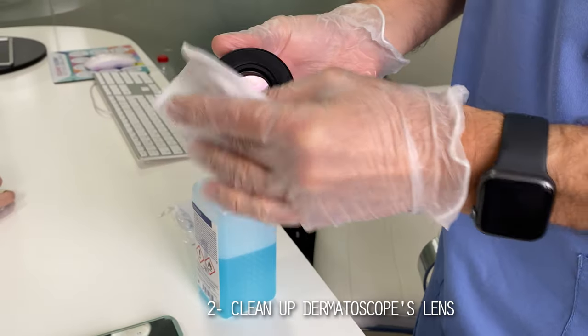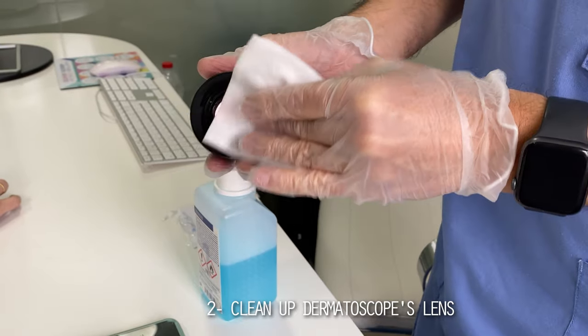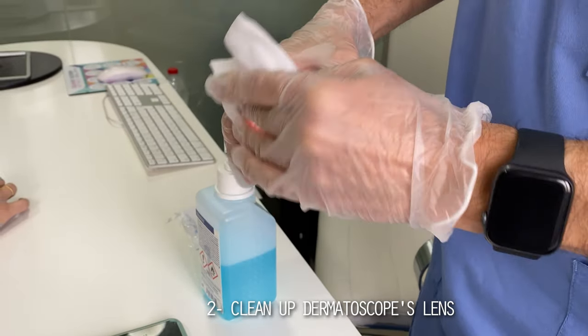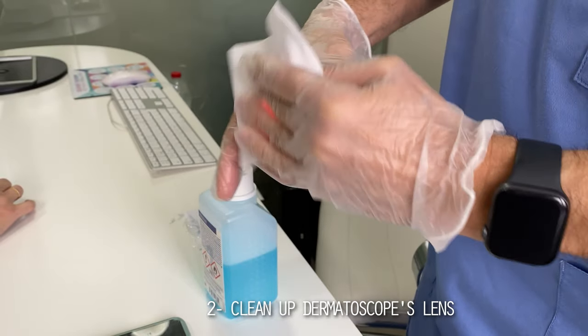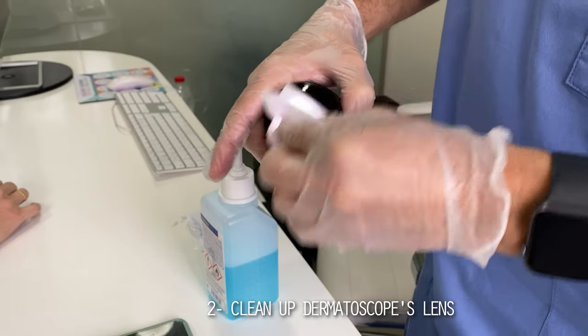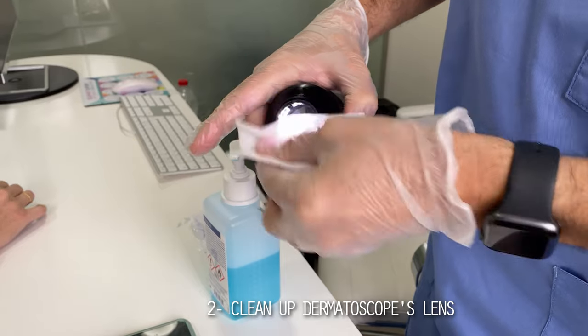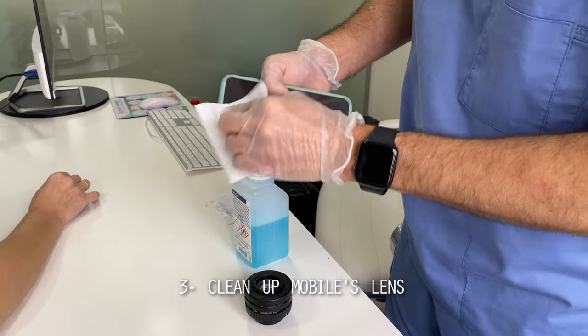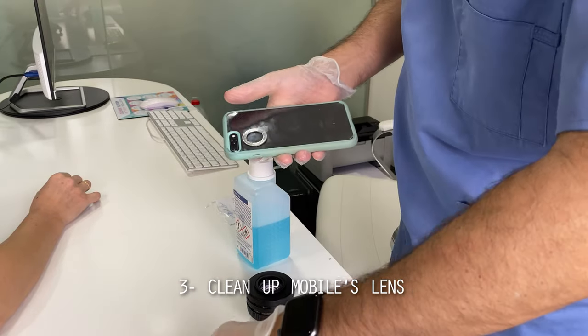The next item on the checklist is to clean the dermatoscope by using an alcoholic solution, for instance. You need to make sure that you clean thoroughly both the front and the rear of the dermatoscope lens, and this needs to be done before examining any patient.